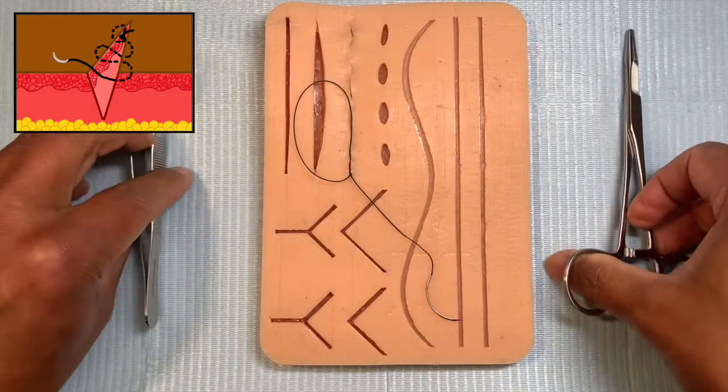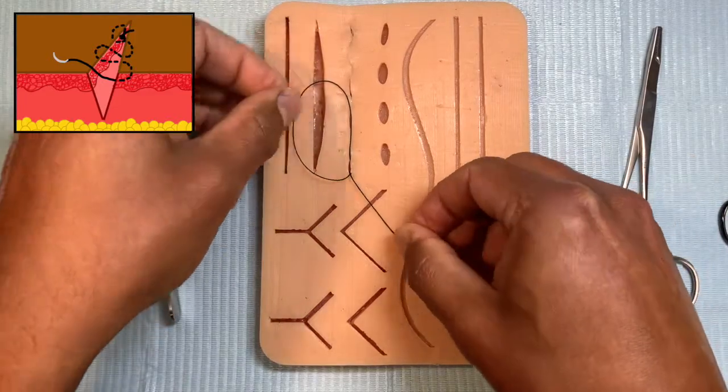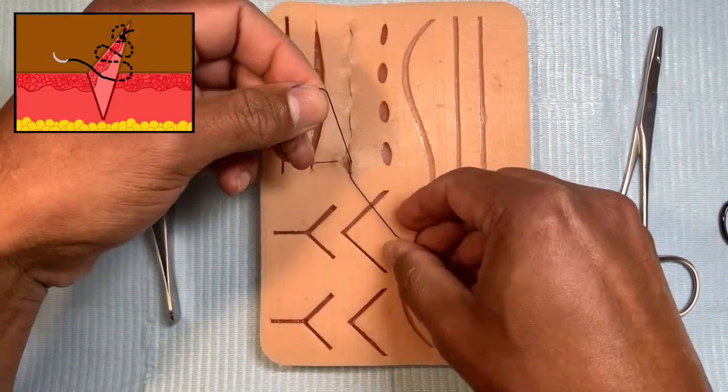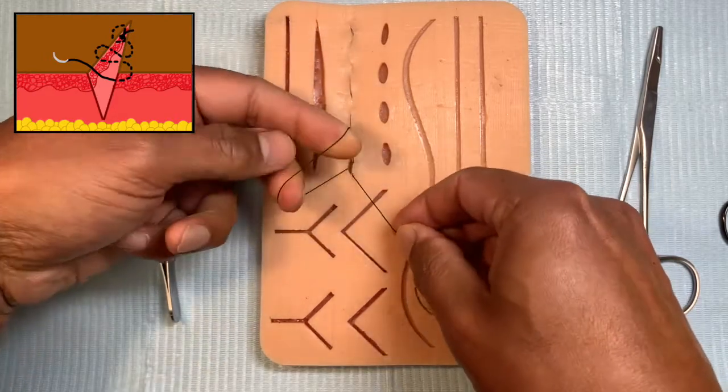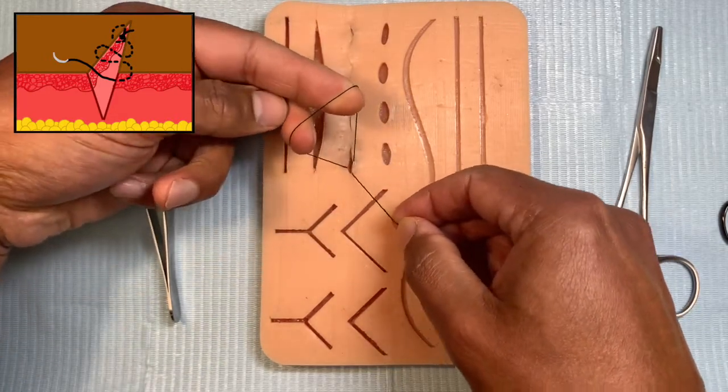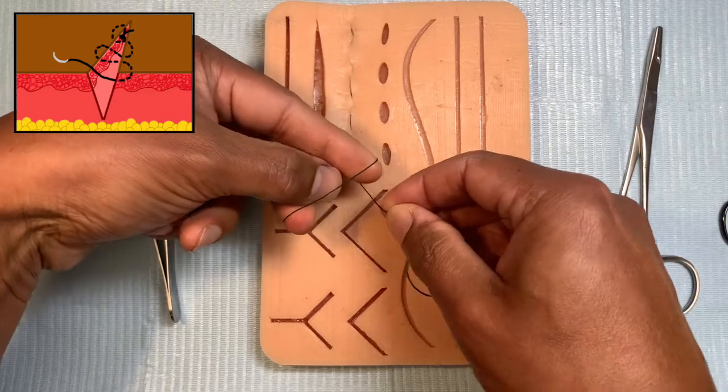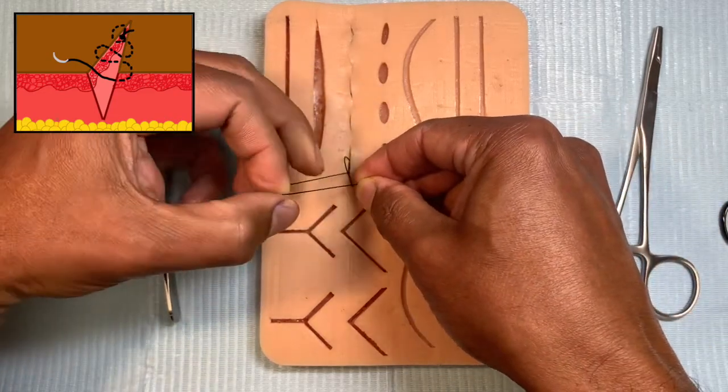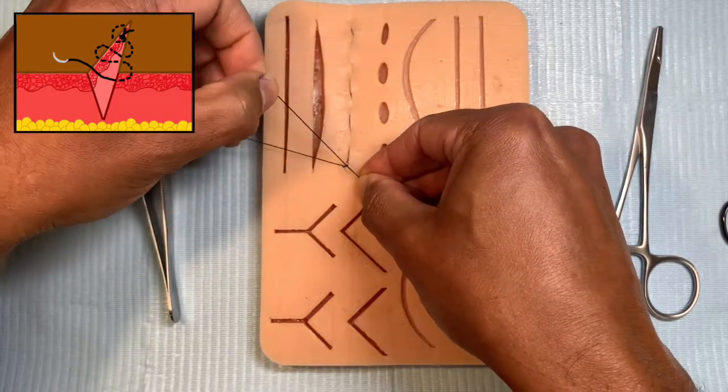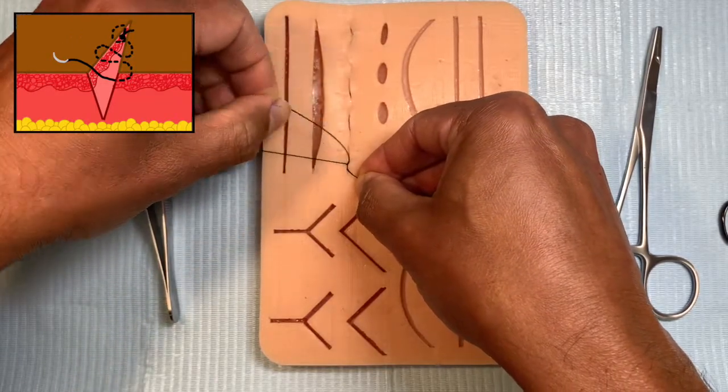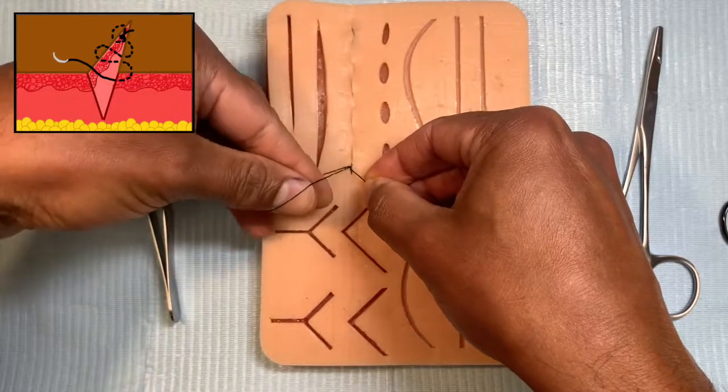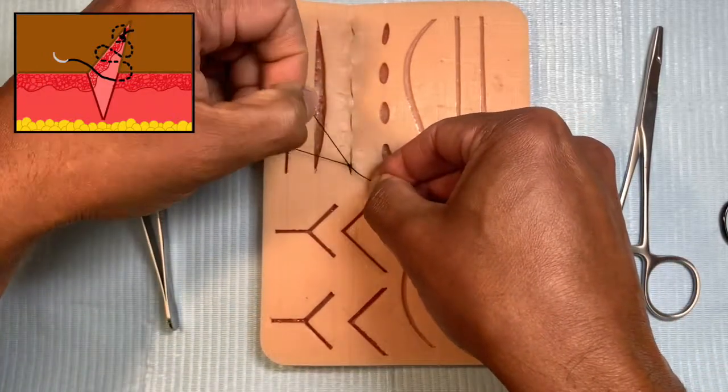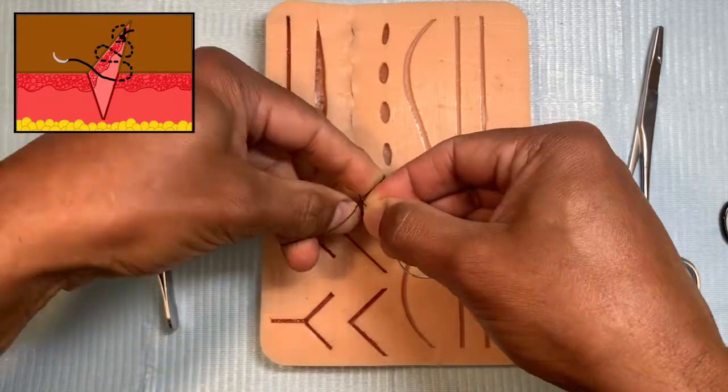In the Aberdeen knot, also called the fisherman's knot, you're making a loop with what you already created and then passing this thread with the needle through it. Pull it through. You need to do this three times: a second time and then a third time.